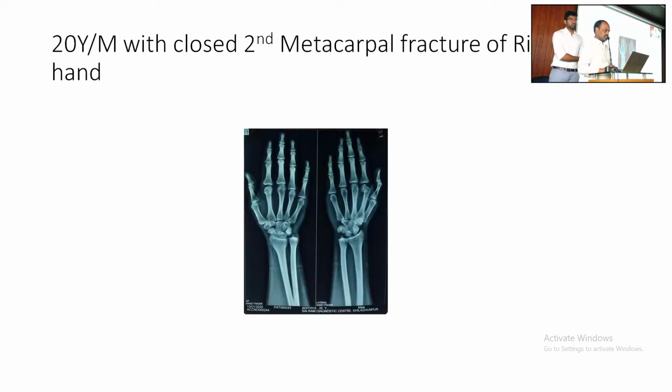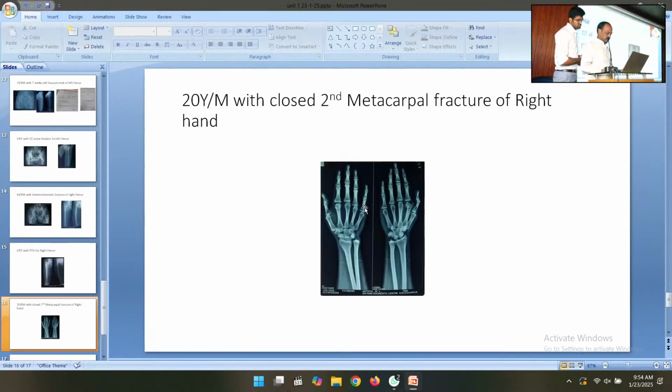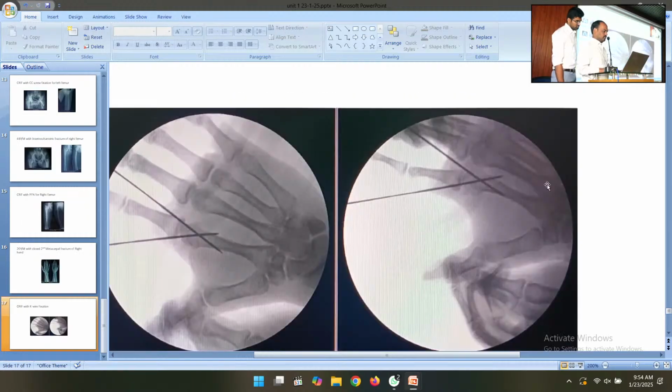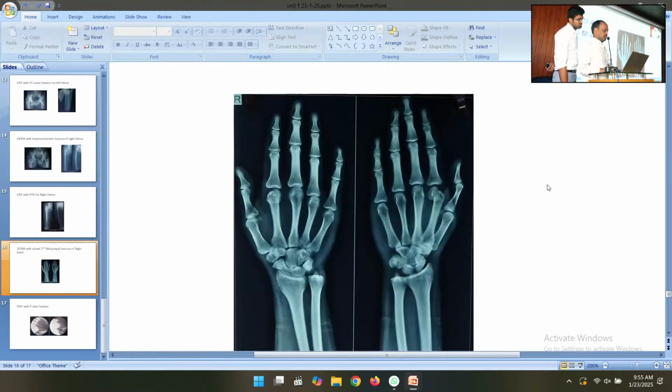20-year male with closed second metacarpal fracture, metacarpal head fracture of right hand, sir. Zoom the film, sir. Head fracture, right hand. Can you repeat, conservatively this one? The implant is put back on the head, but this is cut. Yes, sir. Okay.